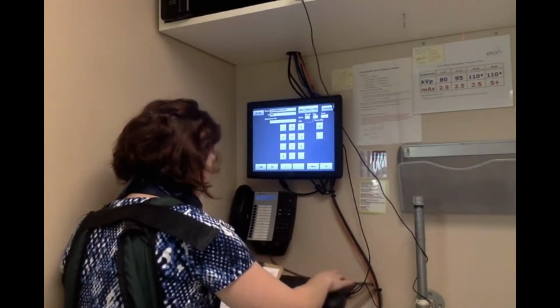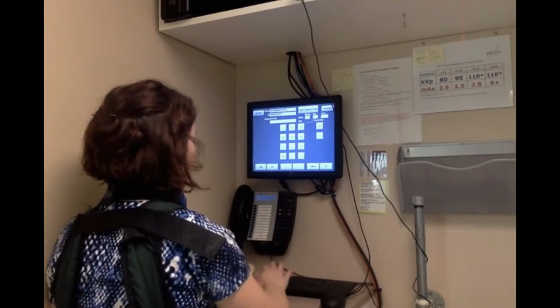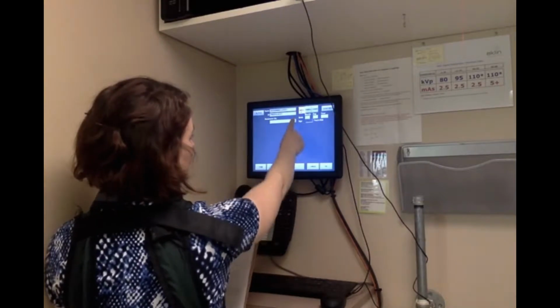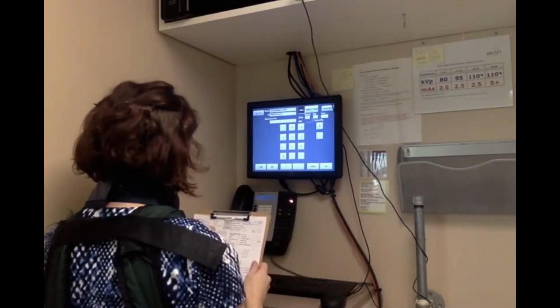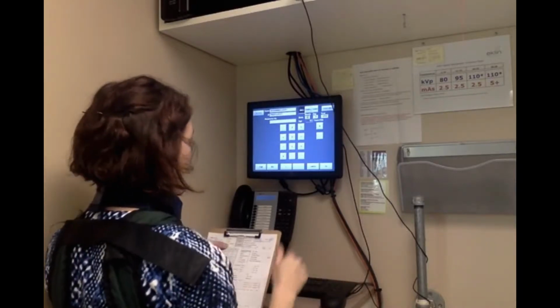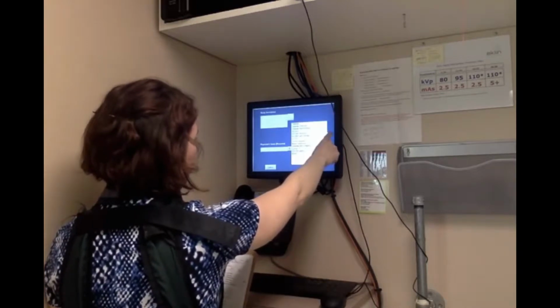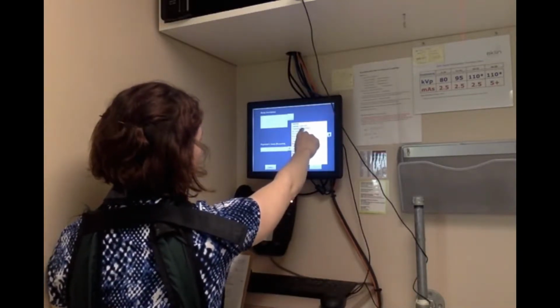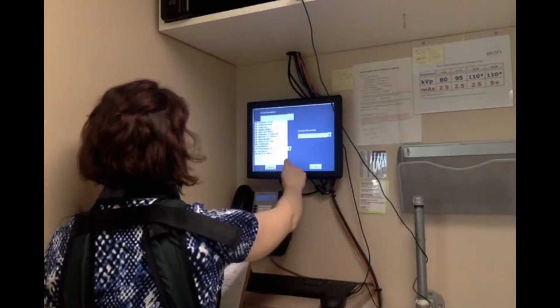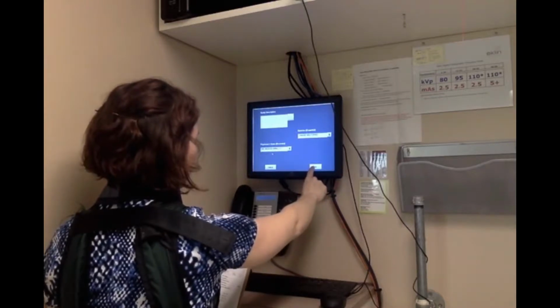So I'm going to put that into the system, followed by his first name so that we can easily identify him later. And then we're going to select he's a male. I'm going to put his birth date in as well, so it easily has his date of birth and it calculates his age for us. I'm going to hit study info. We're going to select his species. He's a neutered canine. And this is going to be under one of our many doctors. This is under Dr. Nicole Varallo today, so I select that.